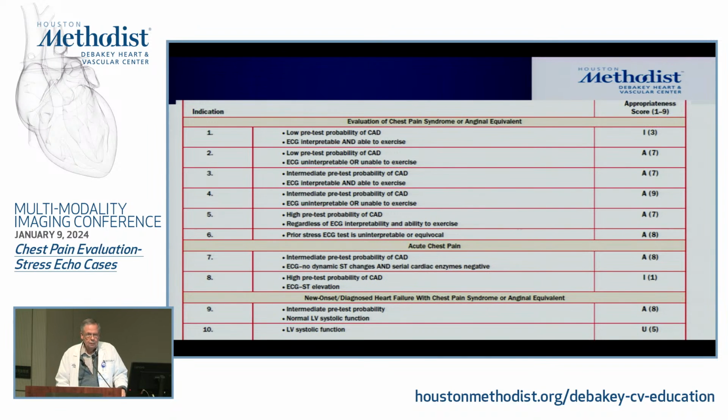And again, the biggest advantage is cost effectiveness, no radiation, and you get your data relatively quickly. As soon as it's done and it's captured, you can go into the system and look at them yourself. You don't have to wait for a lot of processing.